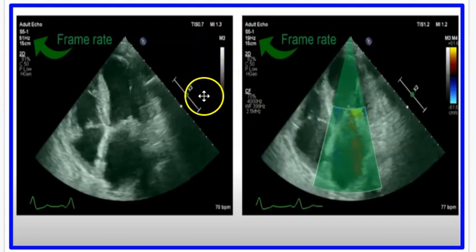And we do that. We keep the frame rate above a certain range so that when the frames are put together, like in the movie we're making, when the machine is scanning through this heart, it doesn't make it look jumpy or anything. It's smooth.